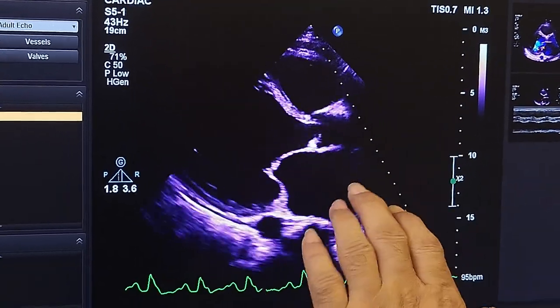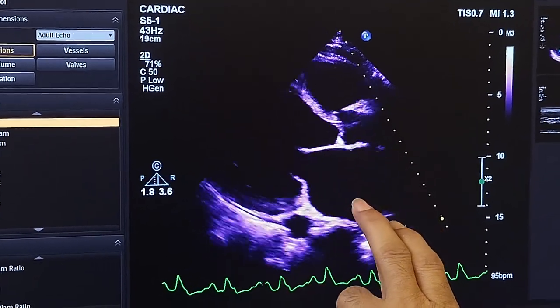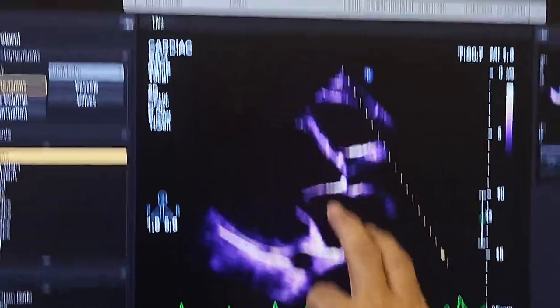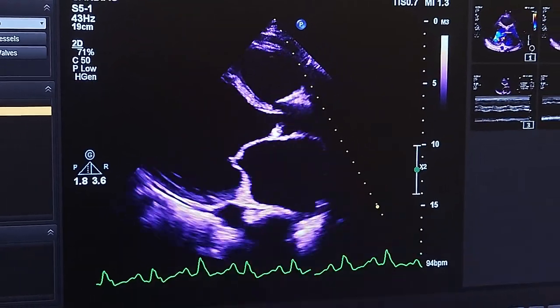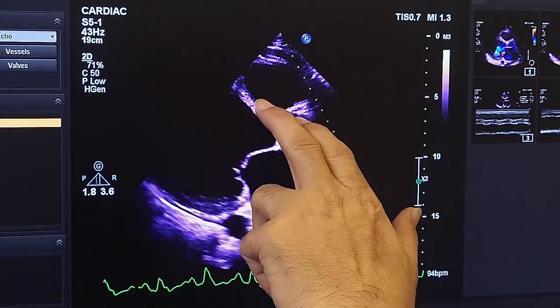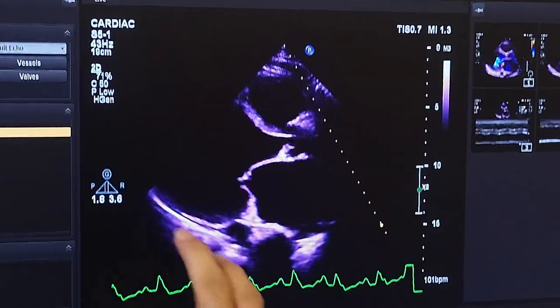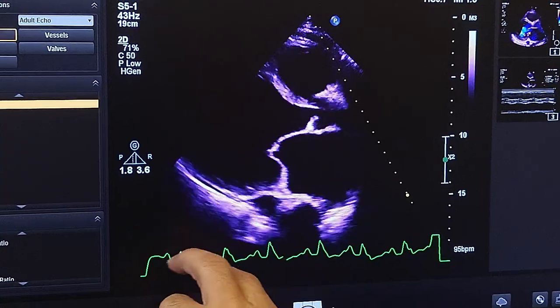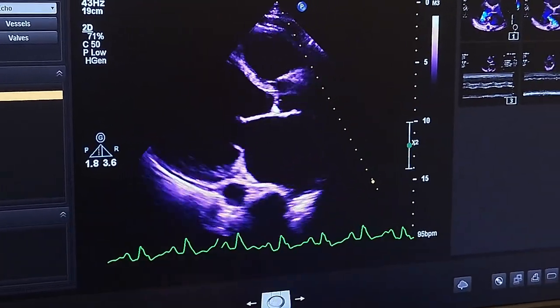We have it's pretty good to look at the left atrium, and it seems to be dilated, and seems to be AML and PML non-coapted, and LV dilated. There is a reduced thickness of the interventricular septum, also in the posterior inferior wall, and there is just a thin layer of pericardial effusion as well.